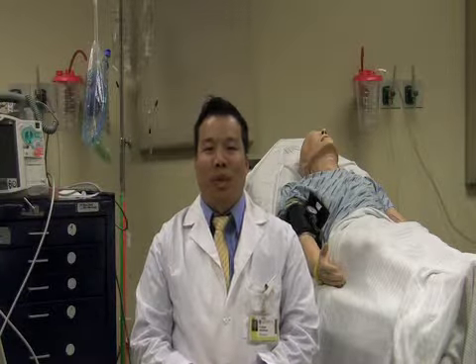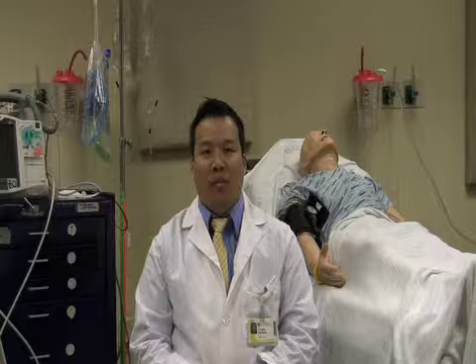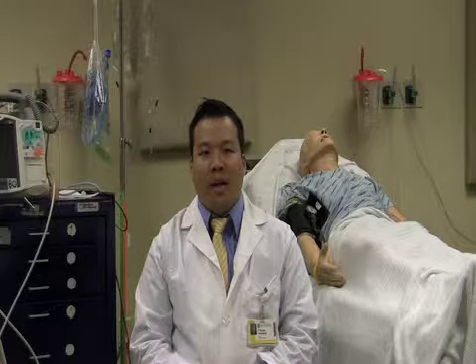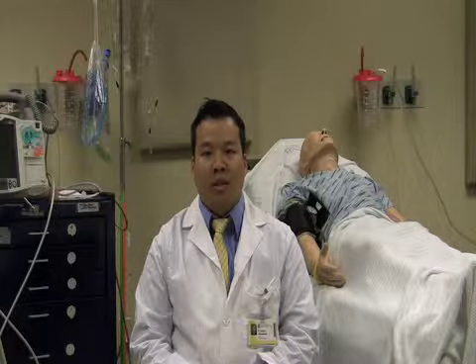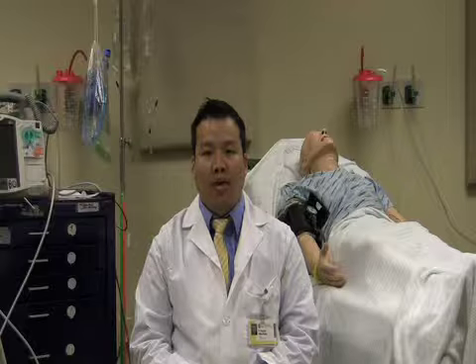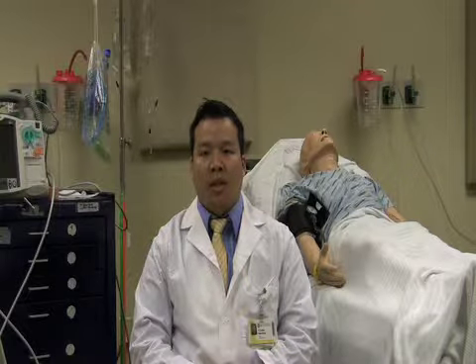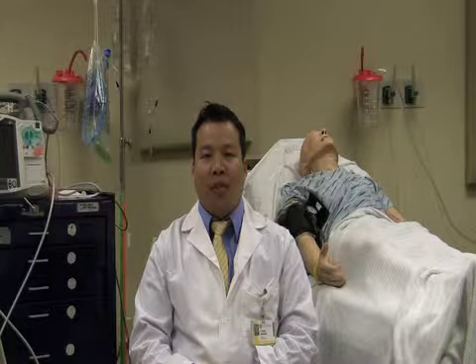The common complications of pacemaker placement include bleeding, which may be represented by a hematoma at the area of incision. Pneumothorax is another complication given any sort of procedure that involves the chest wall, and infection or dislodgement of the leads. Pacemakers typically fail after a prolonged period of use.